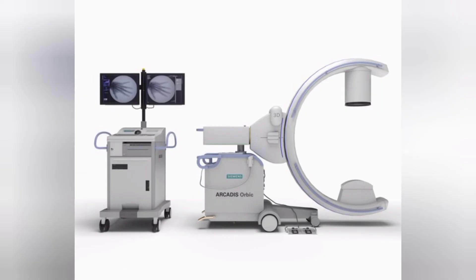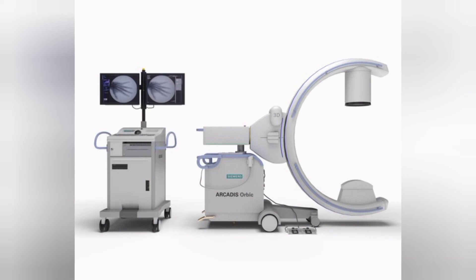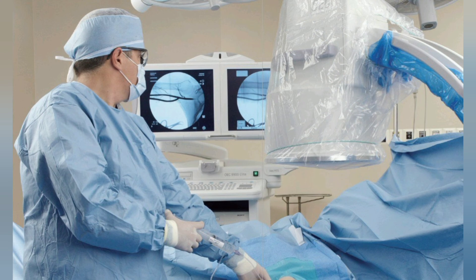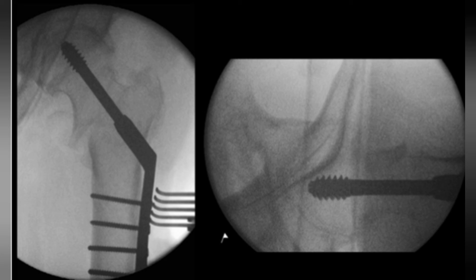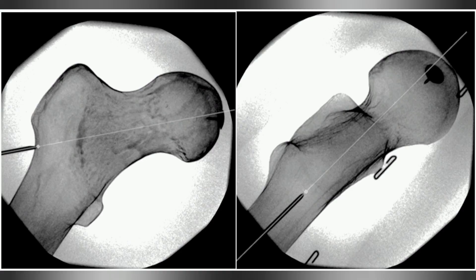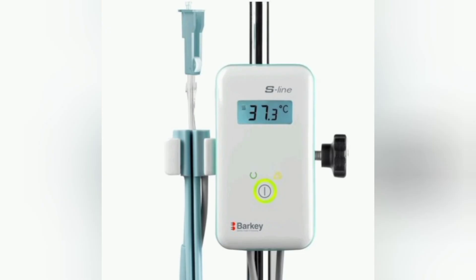The C-arm is a medical imaging device based on X-ray technology and can be used flexibly in different orientations. During some surgeries, the surgeon needs a live location of implants or a specific region of defect in real time. To access the precise surgical area, the C-arm provides live images and location on the screen as shown in the image. This equipment has been used largely in orthopedic surgeries.